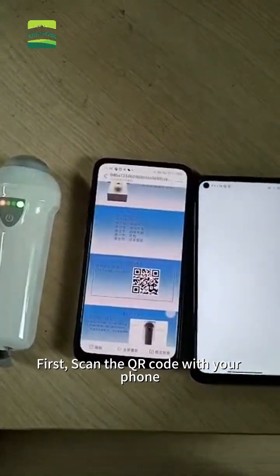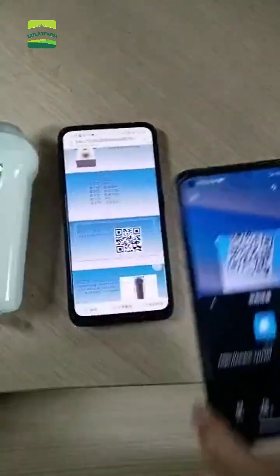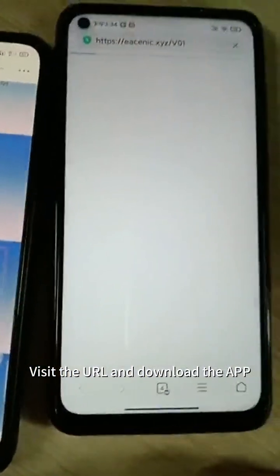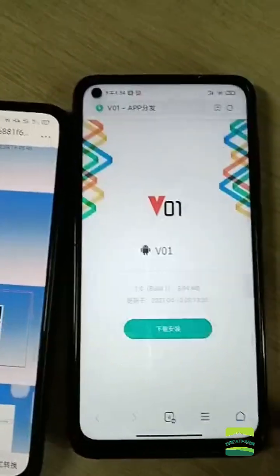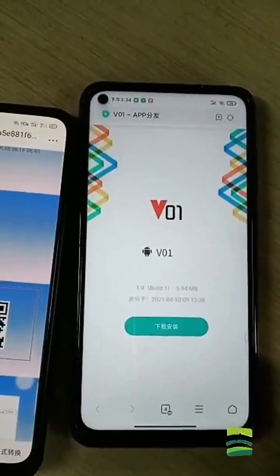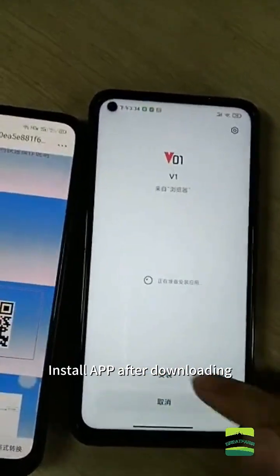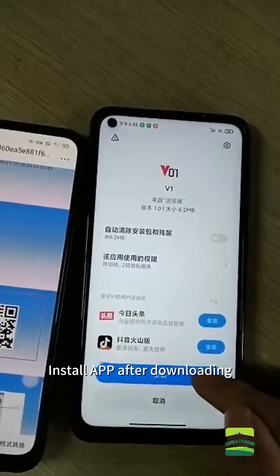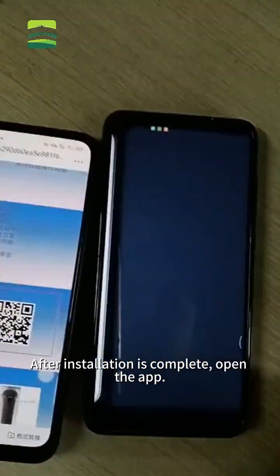First, scan the QR code with your phone. Visit the URL and download the app. Install the app after downloading. After installation is complete, open the app.